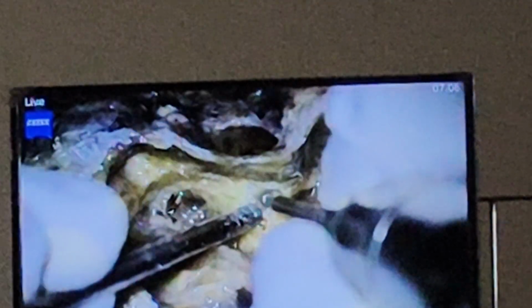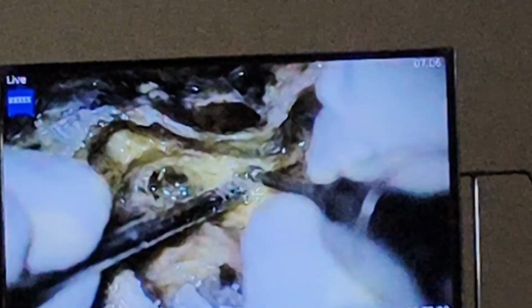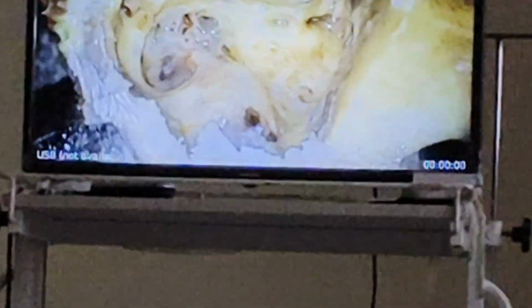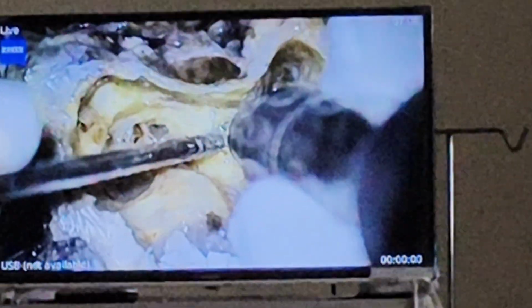So this is a commonly done technique in cochlear implant. We have posted it around. So this procedure earlier was done for removal of cholesteatoma, but today it is not done because we have better procedures. So usually this procedure is reserved for cochlear implant. So now I am just opening there. 1 mm diamond burr.